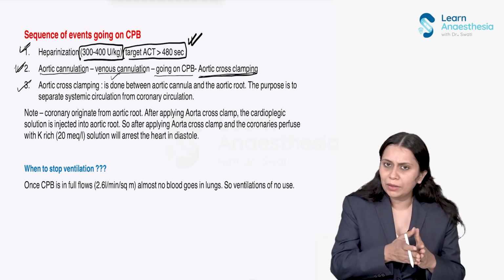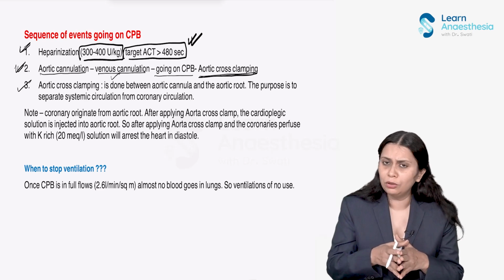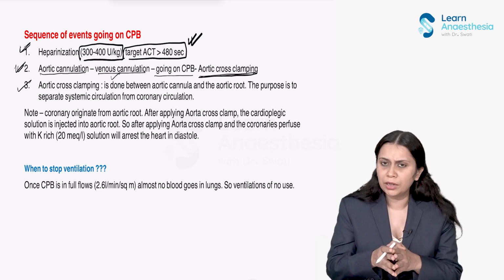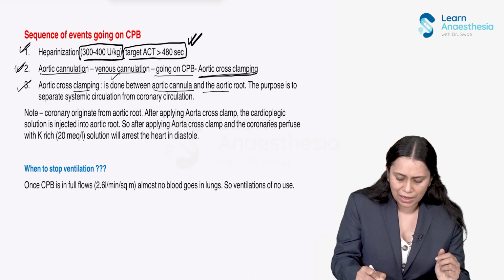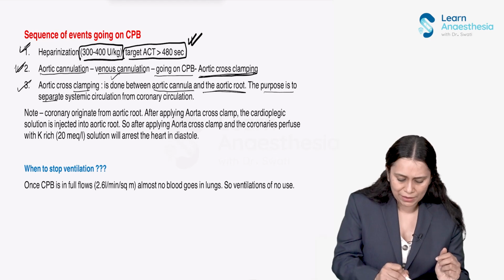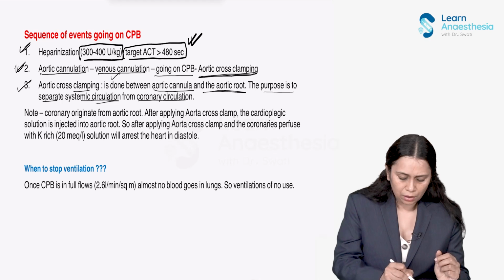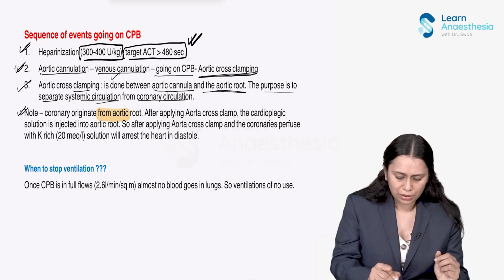As I said, to separate the coronary circulation from the systemic circulation, because we know the coronaries originate from the aortic root.